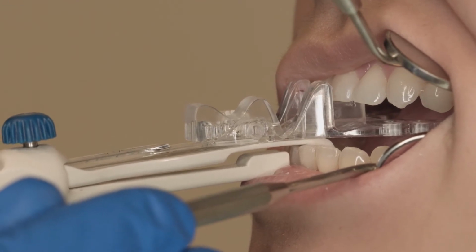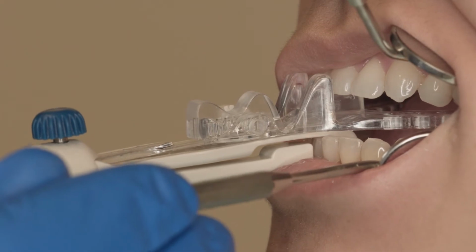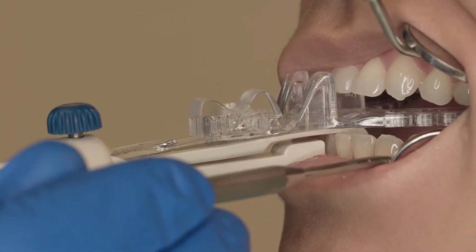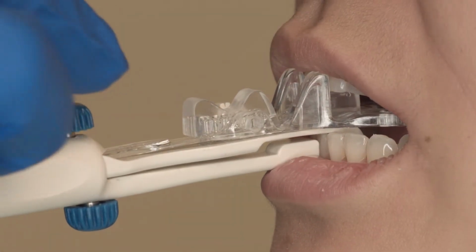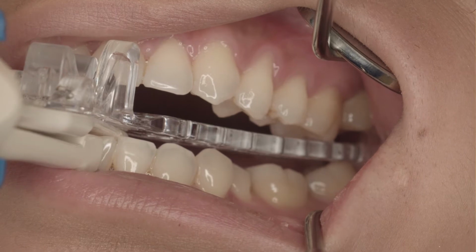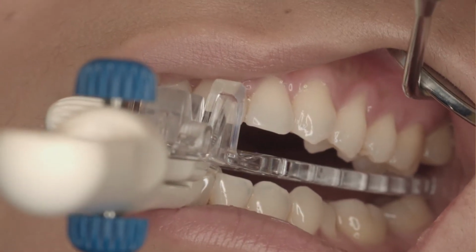If an anterior breathing hole is requested, you must ensure that at least 5mm opening is provided between the two closest front teeth. This ensures adequate material is maintained for appliance integrity. This final position is a preview of the vertical dimension required for a SomnoDent device.